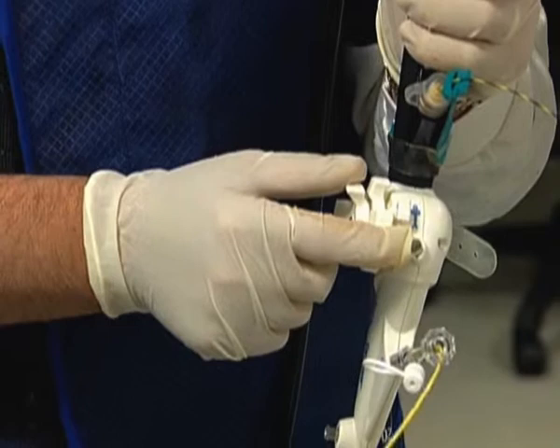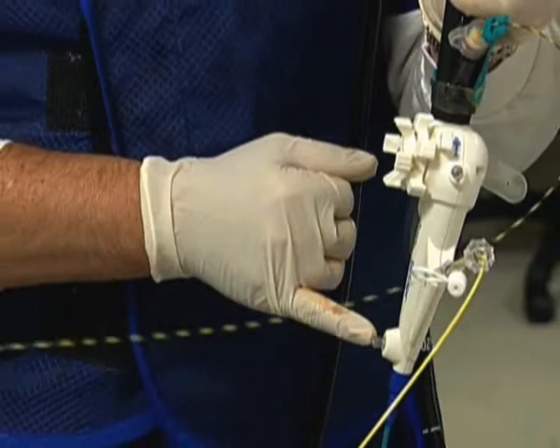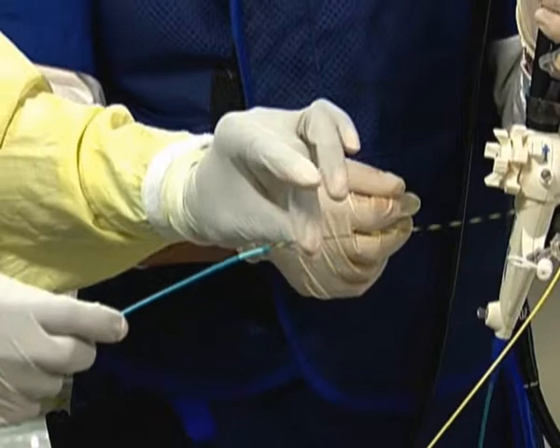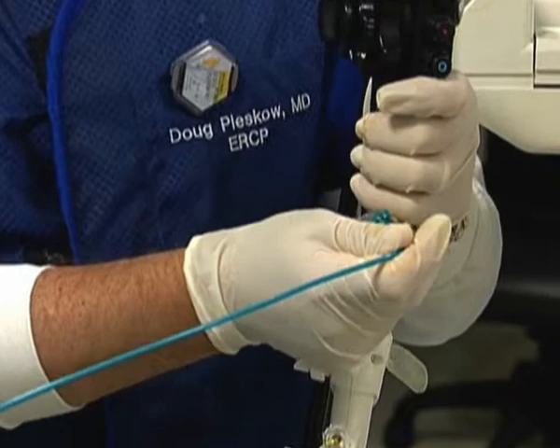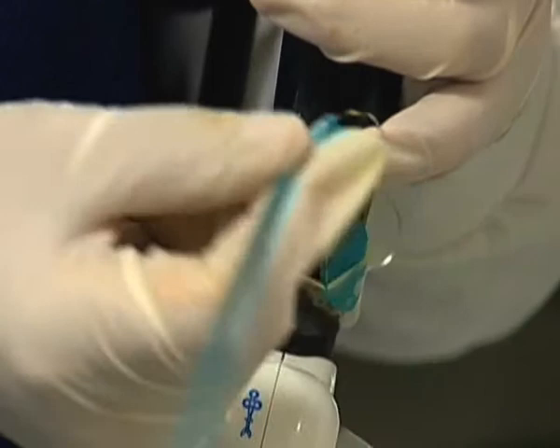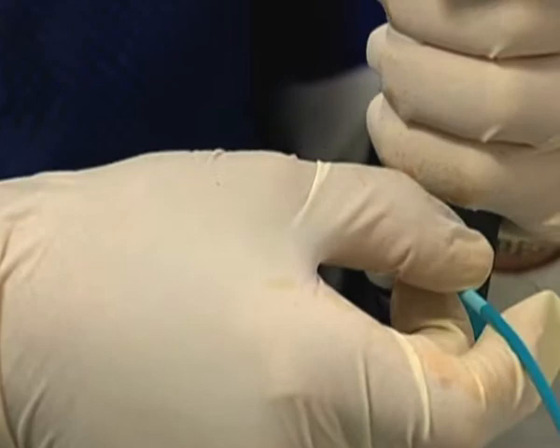The SpyGlass probe goes through the spy scope. This is the guide wire and device port — our guide wire will come out of here, and we can put any device we need. Today we will be putting an EHL probe down, but we can also put down a biopsy forceps as well. We have independent water irrigation here, so water or saline can be infused to clean the duct. The setup time is fairly short. The spy glass itself is preloaded into this blue catheter down to the level of the scope, kept inside the spy scope to protect it.